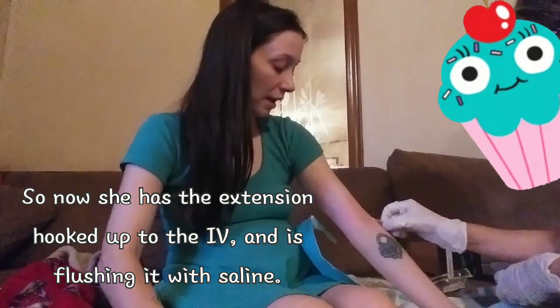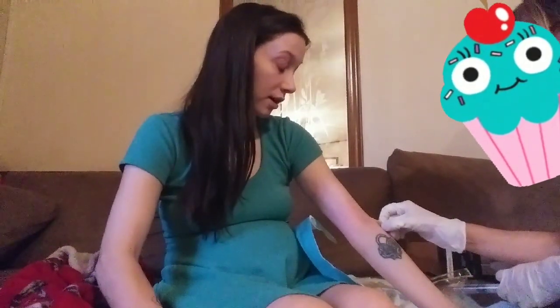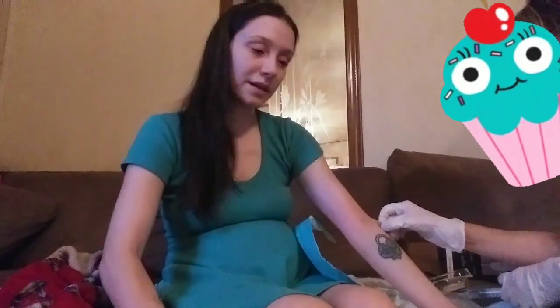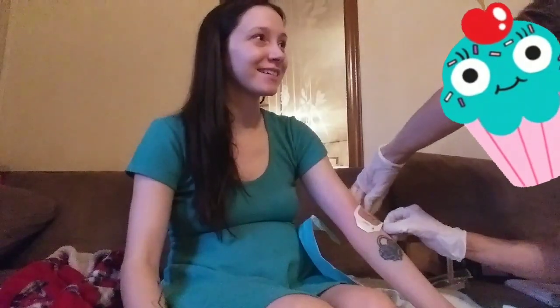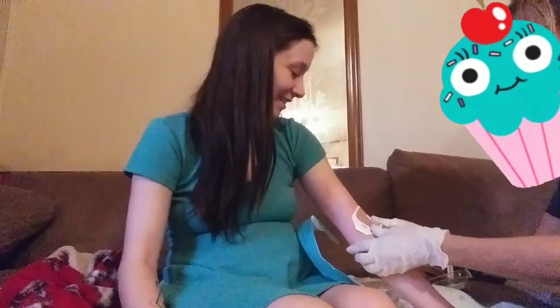That thing was looking pretty good. We haven't used that one — I think it's been about a month because it was looking rough, but we've given it such a break. I smell and taste it too — okay, good, the saline flush. I can do like a victory dance today. I put out like three saline flushes, extra gauze, extra IV needles just because I know half the time we go through all of it. So instead of having to get up to keep grabbing it, I'm just going to set all of this out. Because sometimes we go through three needles or multiple pieces of gauze and multiple saline flushes trying to get it in.